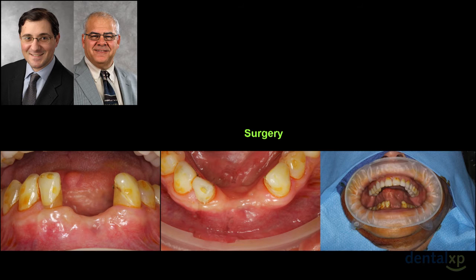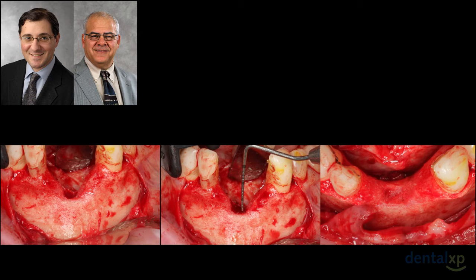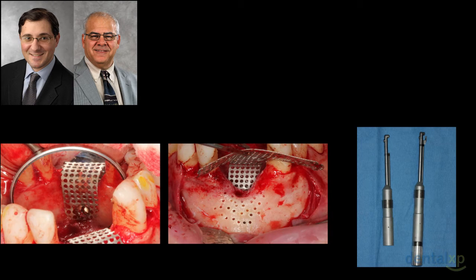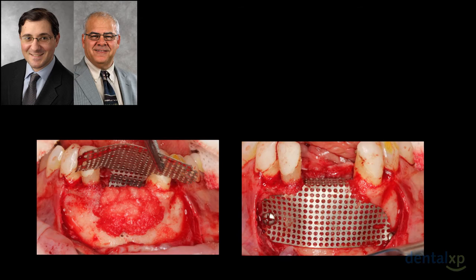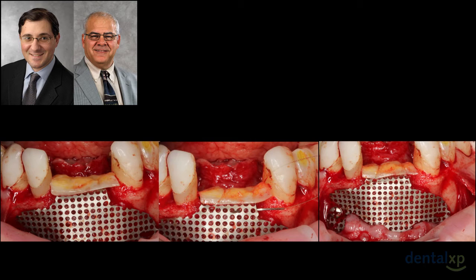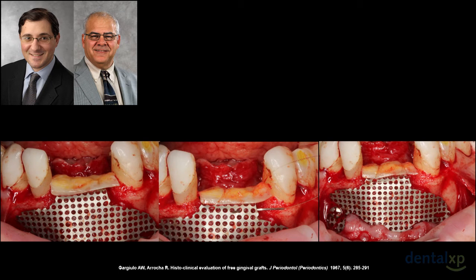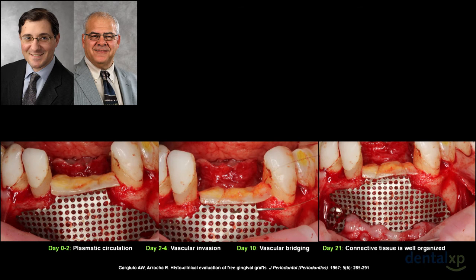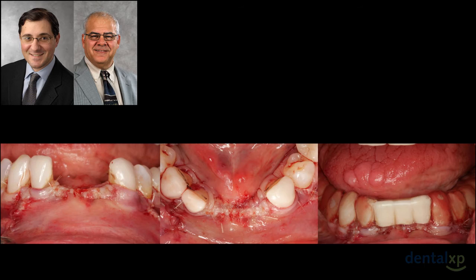Here's the surgery — there's the defect, patient prepped and sedated. We open up the areas, degranulate. Cortical perforations, fixated on the lingual aspect with Stryker instrumentation. There's the space we're going to maintain — BMP and a cancellous allograft. The mesh is fixated into position. I'll oftentimes take a connective tissue graft and suture it to the mesh, because in the event of any opening, I'd like to have a vascular base. The connective tissue graft heals initially by plasmatic circulation, then by vascular invasion and bridging — at 21 days the connective tissue is well organized.